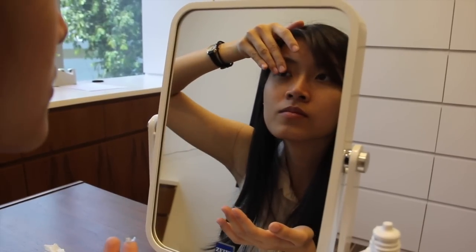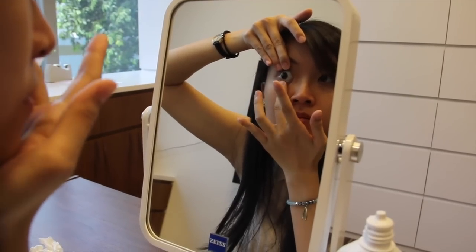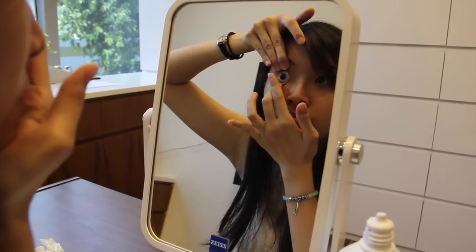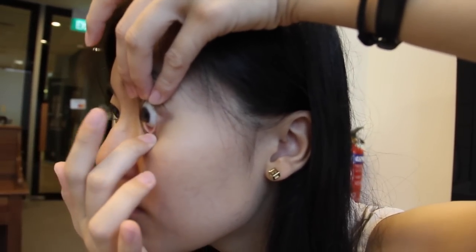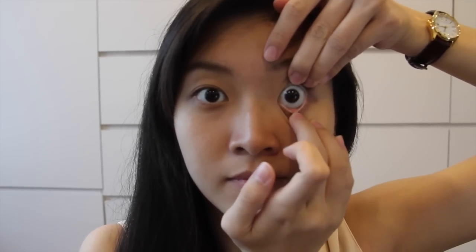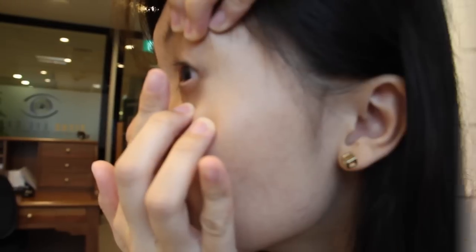Holding your eyes open during insertion is one of the most important steps to successful insertion. Make sure that you are holding your eyelids at the lid margin where your eyelashes are. When you hold your eyes open properly, it should be difficult to close your eyes. Do not hold your eyelids away from the lid margin, as the reflex blinking action of your eyes will make it more difficult to insert the lens.